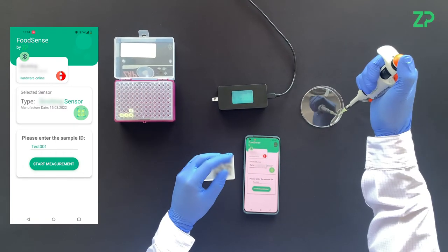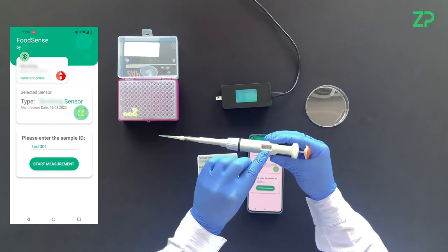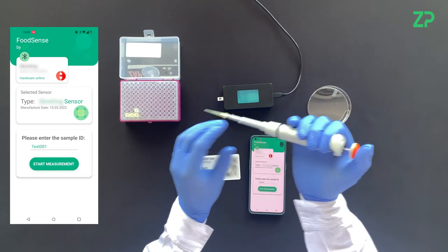In this example, 30 microliters of liquid is pipetted onto a sensor with a micro well. A specified measurement can thus begin.